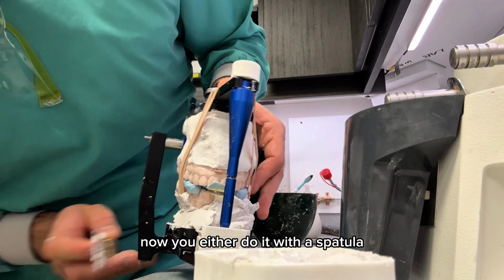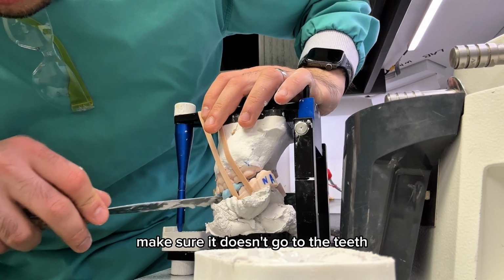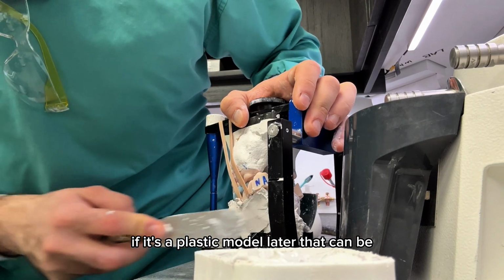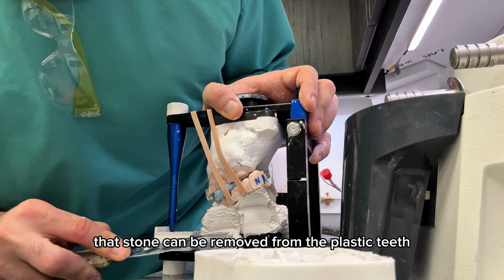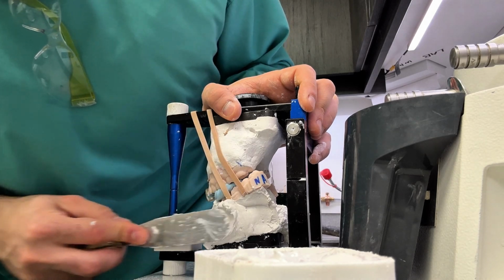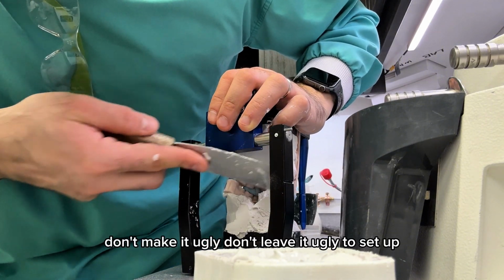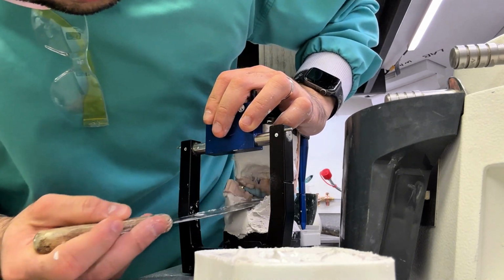Now you either do it with a spatula. Make sure it doesn't go to the teeth. However, if it does, if it's a stone model, that's a problem. If it's a plastic model, later that stone can be removed from the plastic teeth. But still, it's better to make it ideal at first. So take your time. Don't make it ugly. Don't leave it ugly to set up.